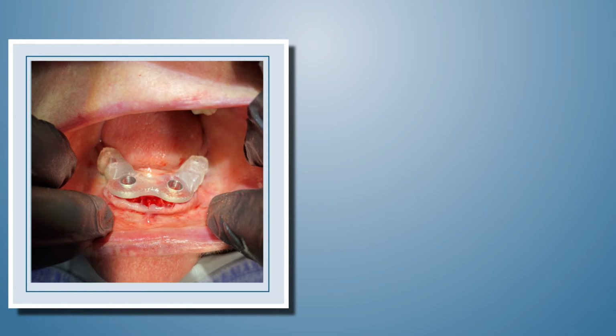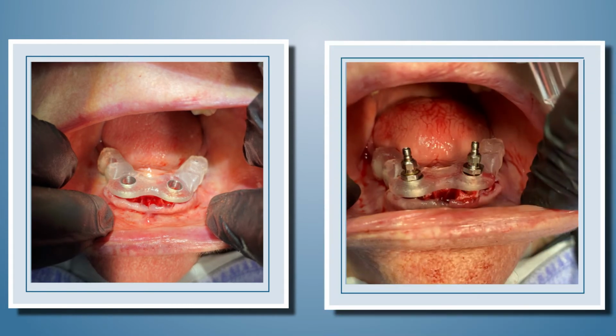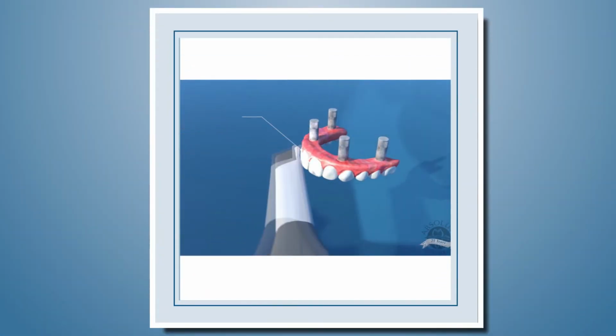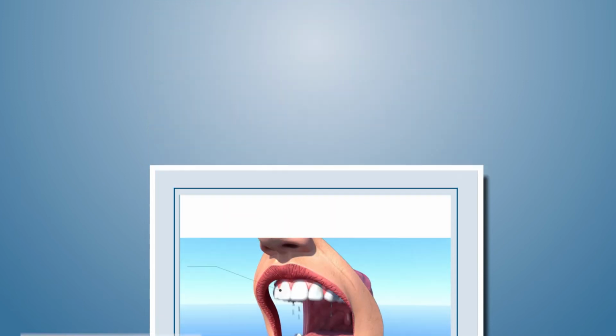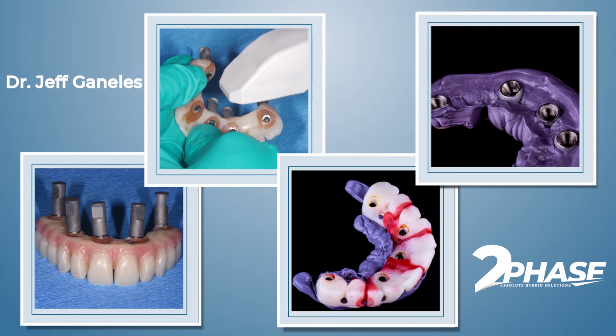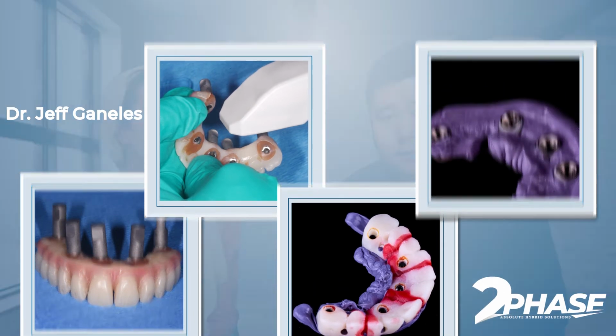The caveat is that it's going to be more invasive, and if angle correction is required, the rotation of the implant remains unknown until surgery. The second way is to act as though you are restoring the existing implants. That means using scan bodies, analog impressions, verifying the model, establishing vertical, and utilizing a fixed scan appliance. Depending on the patient, we can combine a lot into one or two appliances. While this requires multiple appointments on the front end, it pays off on the back end.